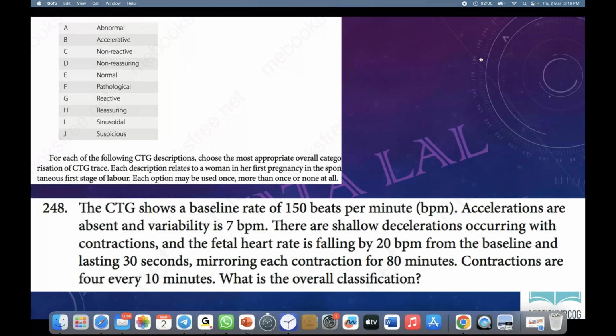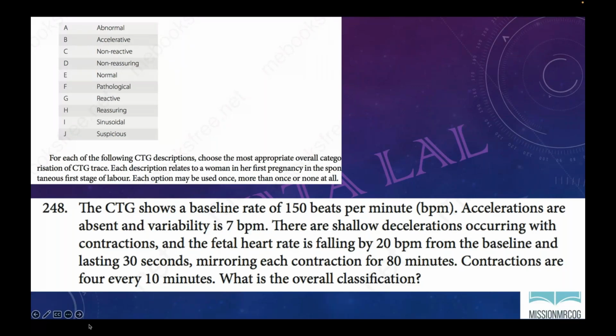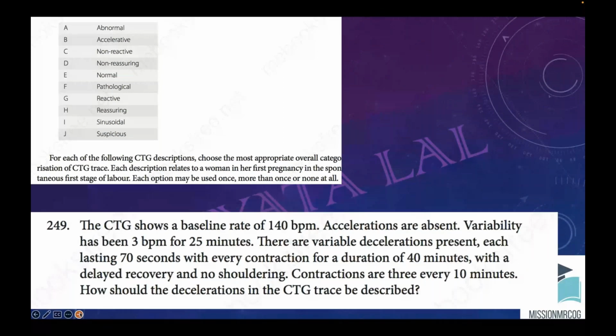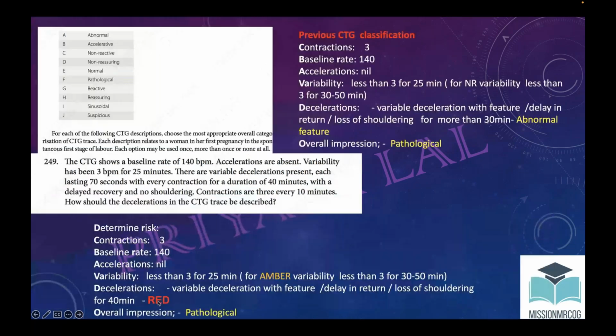Normal, ma'am, because it's early decelerations. Normal. So again, it has got red, ma'am. Red is there, so it is pathological. In the previous CTG also it was pathological, so no change in answer. Okay, this is just to revise it.